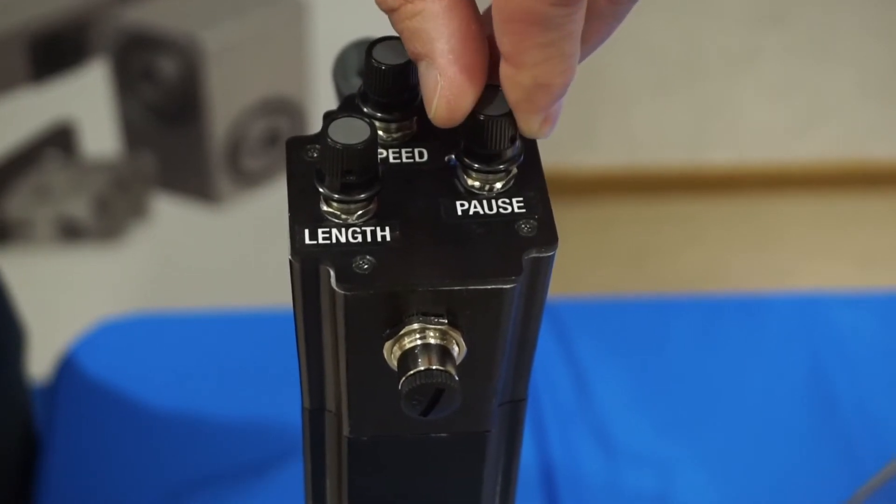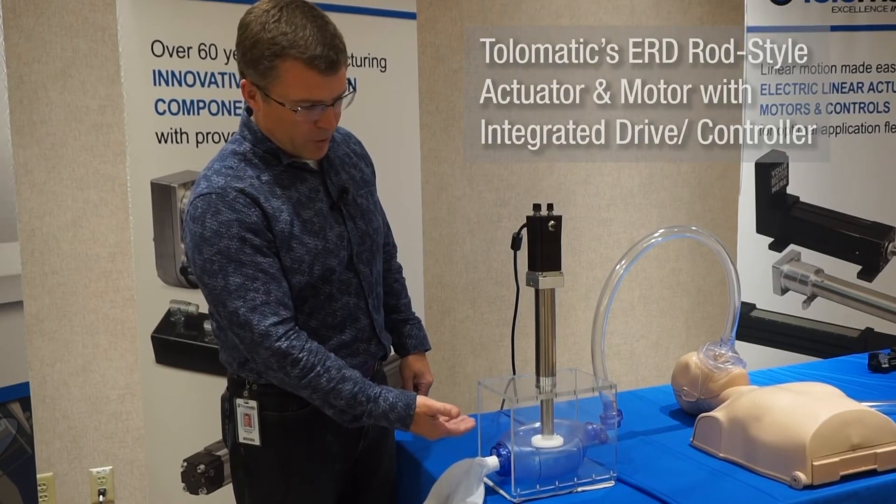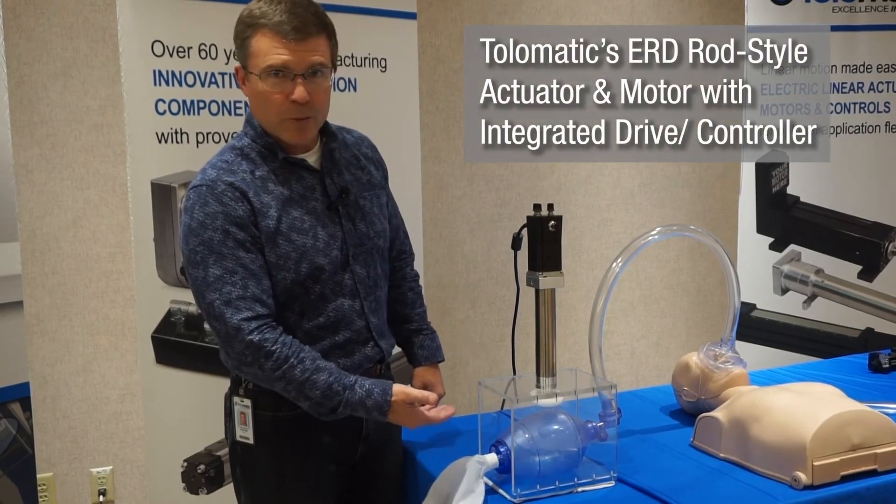And now I can adjust the pause as well. If it's pausing almost not at all now, I can even increase my cycles more.